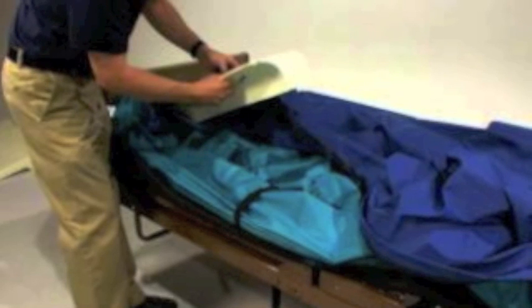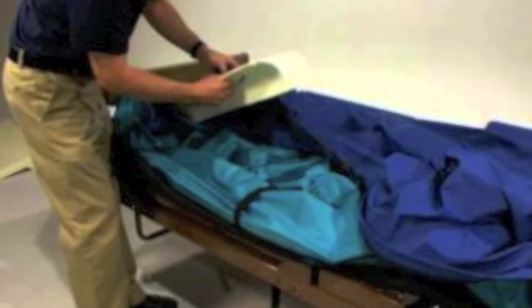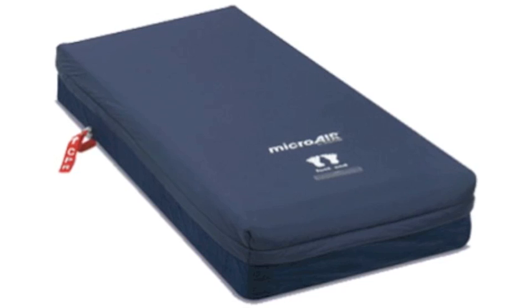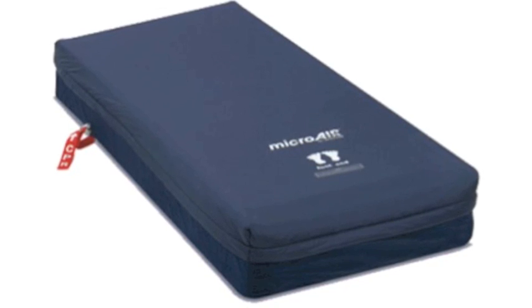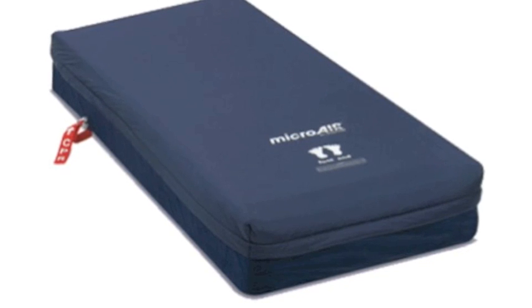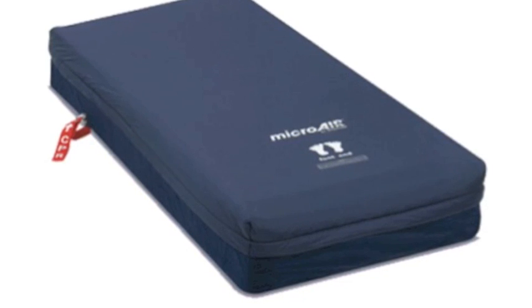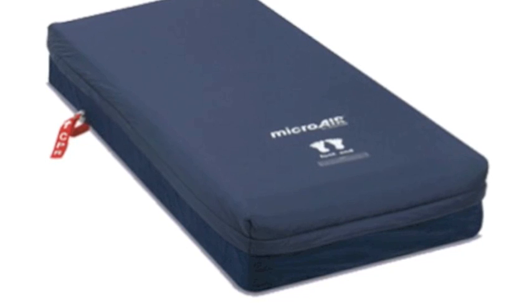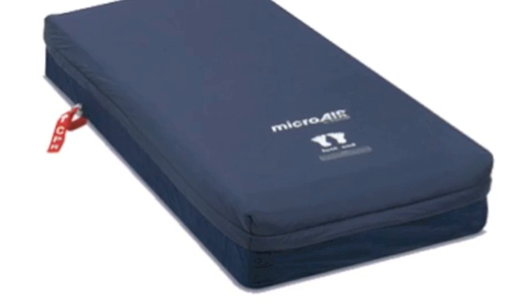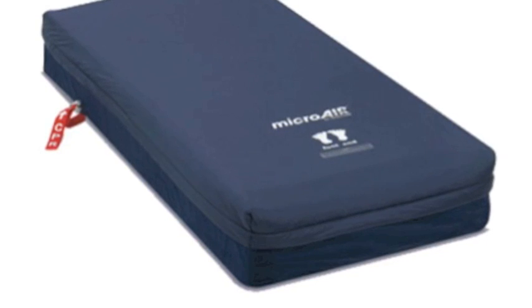Ensure the air pump connector is at the foot of the bed on the same side where the protective cover air hole is placed. Place the air mattress pump connector hole through the hole that is on the protective cover. Once you feel the air mattress is correctly placed, zip up the protective cover. Once this is complete, make sure you secure the mattress to the bed frame with the safety straps on the bottom part of the protective cover. Note that our air mattress is still deflated and will not look like this picture until inflated.